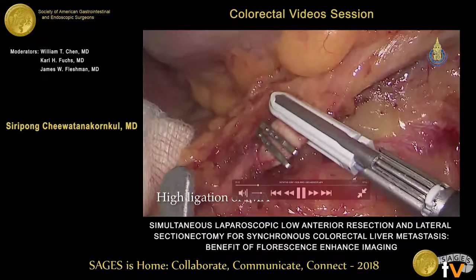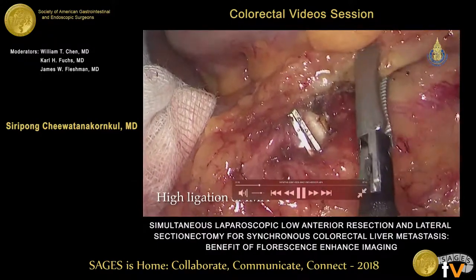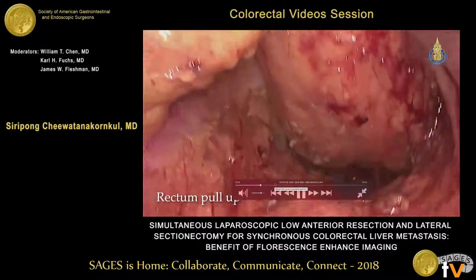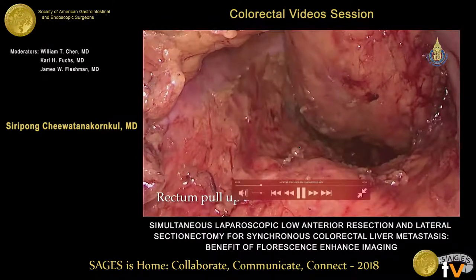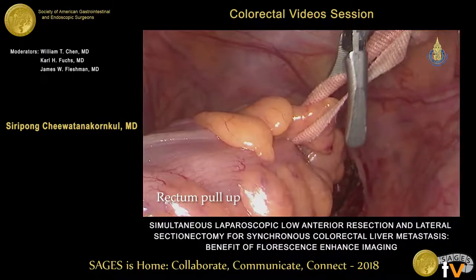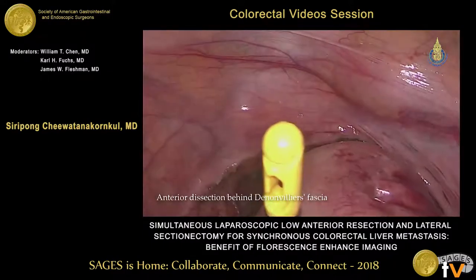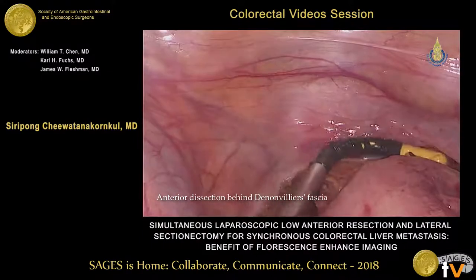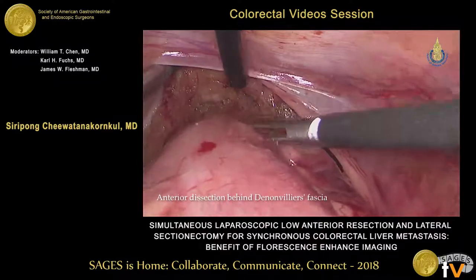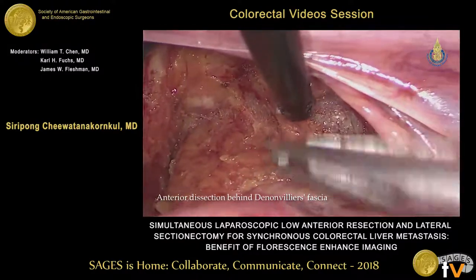We divide the IMA with the vessel sealing device. For the pelvic dissection, you should be aware that the tumor is quite big — it is a 3x3 tumor. We use a rectal pull-up technique to facilitate the dissection. After completing the posterior dissection as far as possible, we turn back to do the anterior dissection.